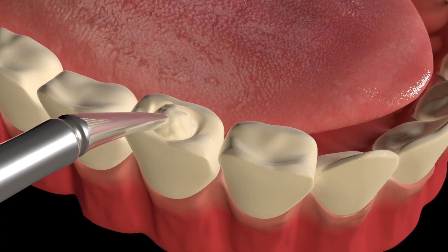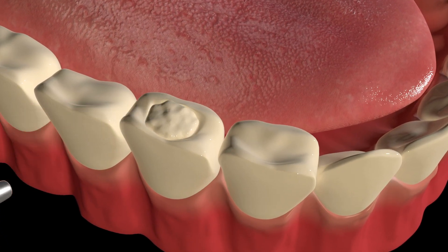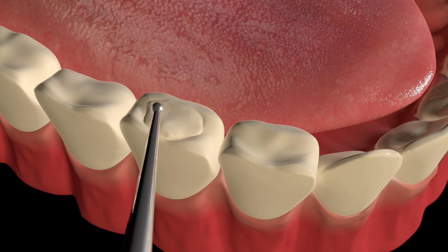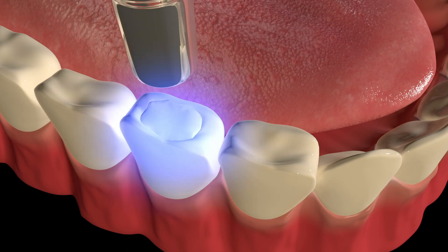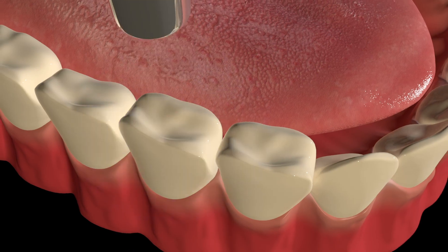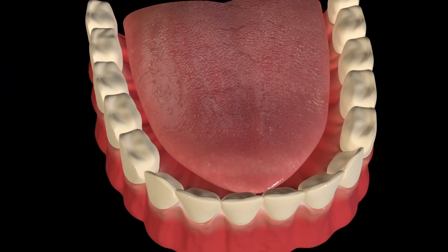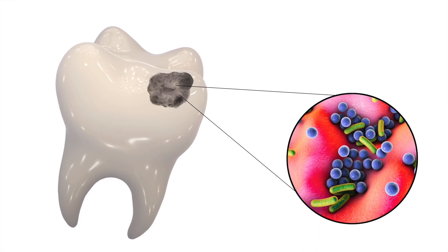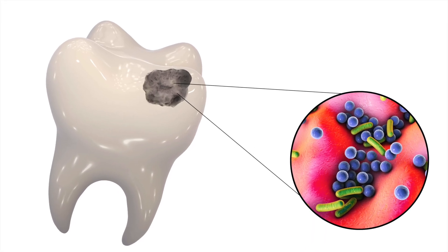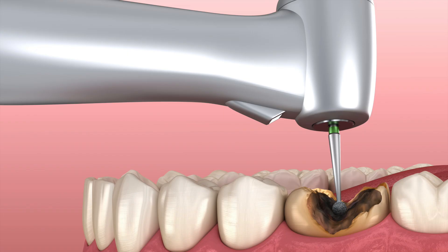Once the cavity is confirmed, the dental procedure begins. Your dentist administers local anesthesia to ensure you're comfortable throughout the cavity filling procedure. This prevents tooth sensitivity and pain during the tooth drilling process.